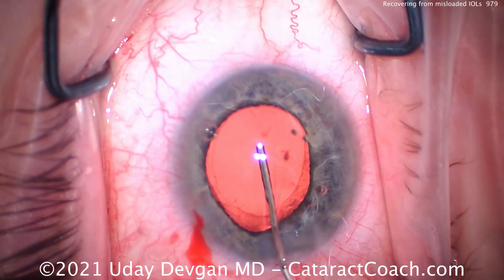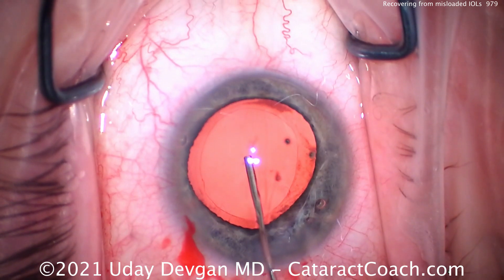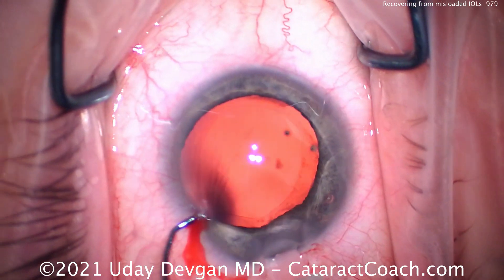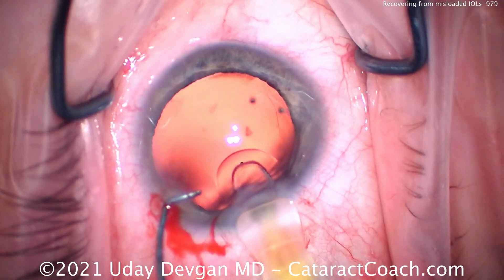This looks like a routine case. There's a nice capsule rhexis. We're inflating our capsule bag with cohesive viscoelastic — it's a nice, good fill. And now we're handed the IOL, a single-piece acrylic lens in this preloaded injector, and we start to deliver it, and we notice there's a lot of resistance.